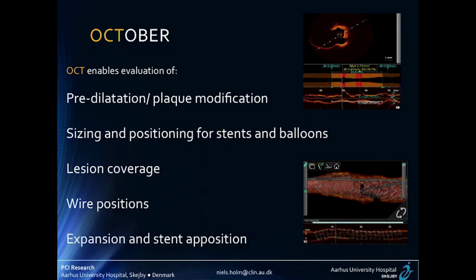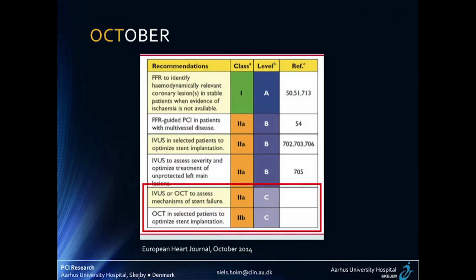So at this point, we have no strong clinical evidence. We have multiple publications on OCT and how to use OCT, but it has not been shown that using OCT actually improves clinical outcome in a strong way. We have a couple of mid-sized trials, but still we don't have any publications here that could move OCT up towards a 1A indication. Still, we have a new technology. We have many new technologies, but OCT has already entered the guidelines just for being a promising tool and based on all the available evidence.